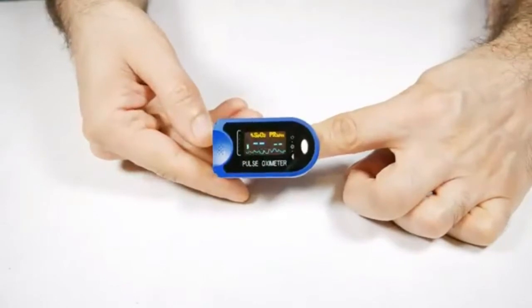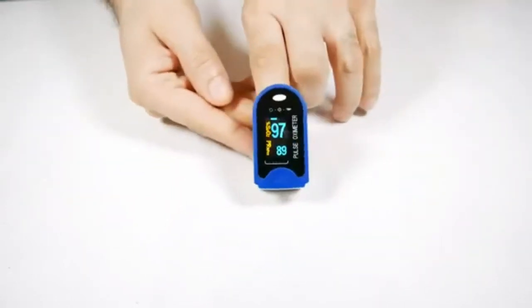Fast and convenient readings — SP02 and pulse rate are graphed on the bright LED display.